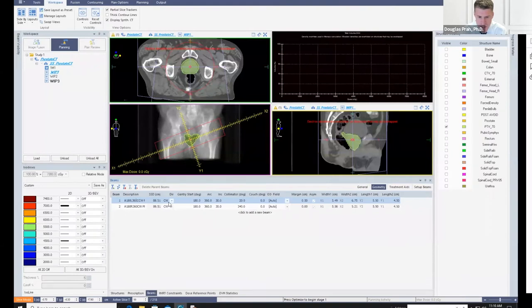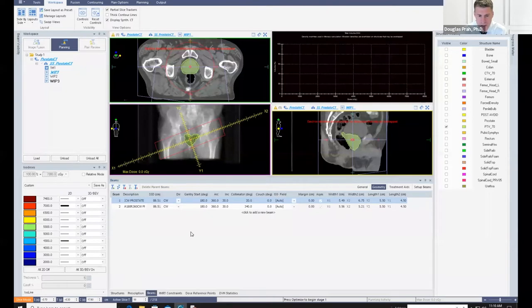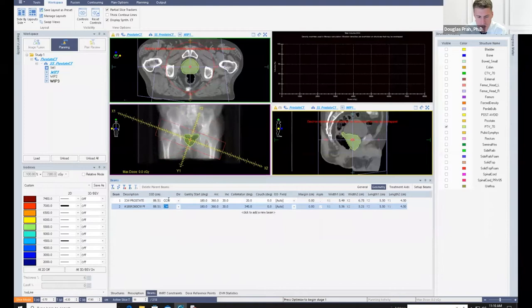Again, in a case like this, if you're doing two arcs and we have it set for one arc per rotation, I find it's always good to start with a counterclockwise. Usually the KV cone beam on the LINAC is going to be ending on a clockwise, so a counterclockwise is a better starting point. It's a little more efficient. If you're going to do a single arc, then you can see it here. I've got these two beams.